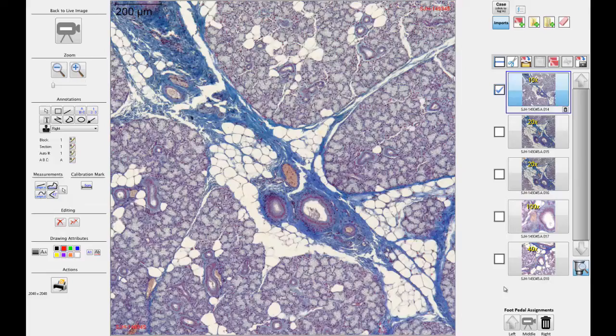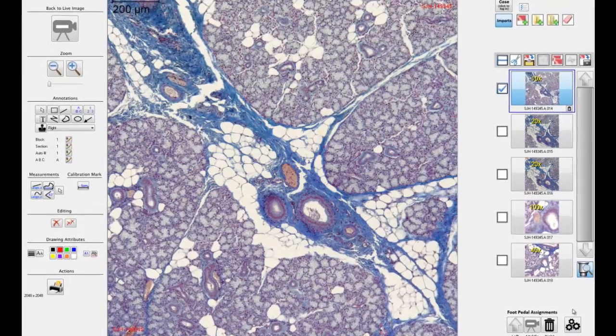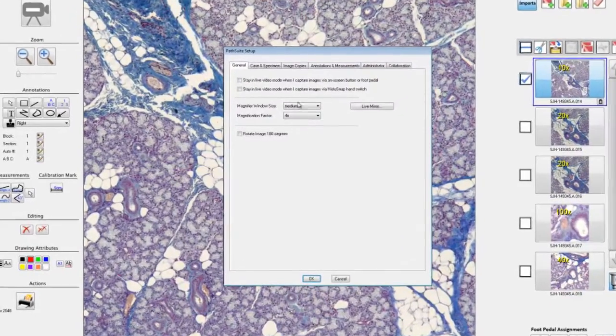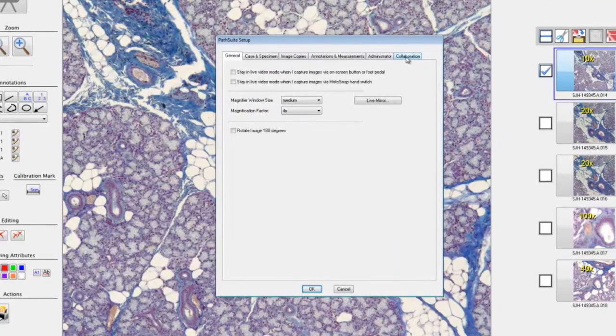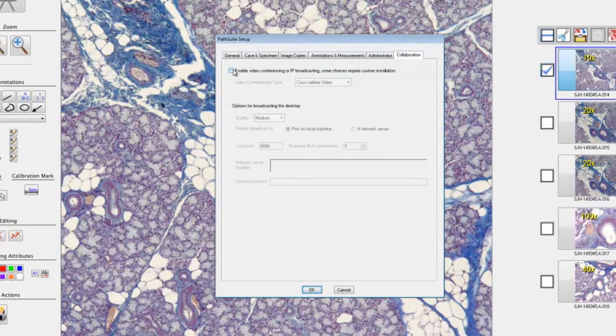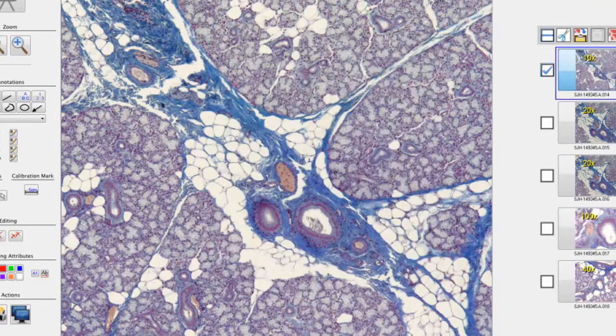PathSuite's telepathology interface provides single-click connectivity to your colleagues for needle biopsy and frozen section consults, as well as procedural guidance to your junior associates. As a fully interactive interface, all features are shared, including live video and audio feed, as well as control of image acquisition, annotation, and measurement tools.